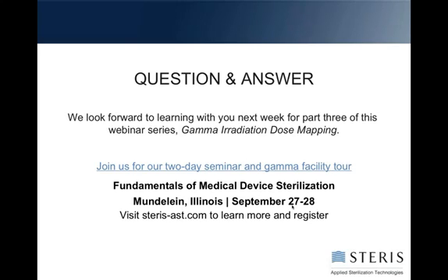Right. Is the validation process and testing for the E-beam irradiation the same as gamma? Absolutely the same. All right. Is there an acceptable minimum allowed percentage of CFUs recovered in inoculated product recovery test?